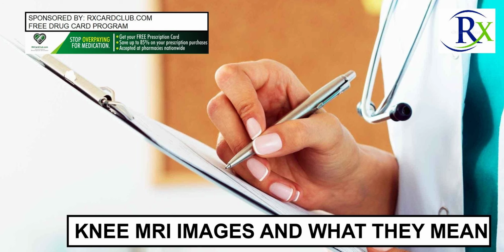Ligaments of the knee are the short bands of flexible, fibrous tissue that hold the knee joint together and moderate knee movement. There are 4 types of ligament. While a normal ACL tends to be difficult to see on MRI, tears will be seen in 90% of cases. These are most often seen in conjunction with a bone bruise and fracture. The ACL is one of the most commonly injured ligaments in the knee.